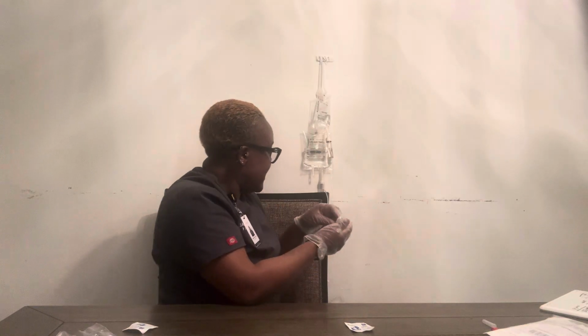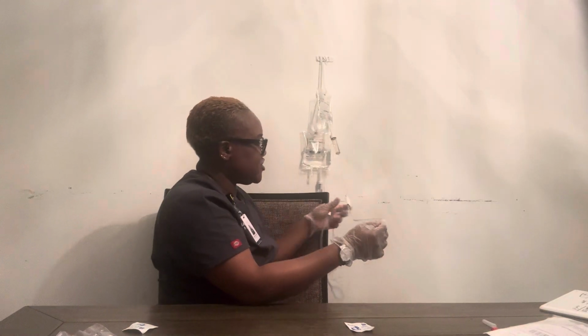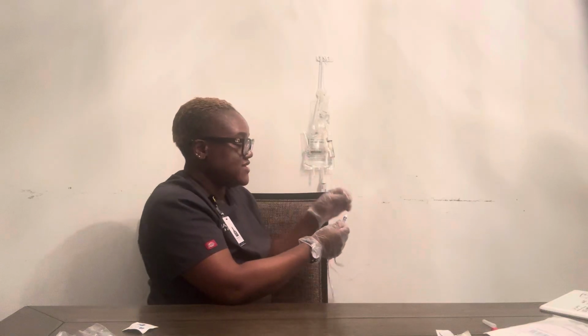Okay, so I have counted for 1 full minute and I got 133 drops for the full minute. So now I have closed my line, and I'm gonna take my alcohol wipe and clean my Y site.